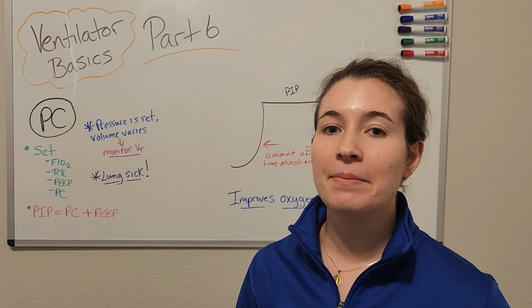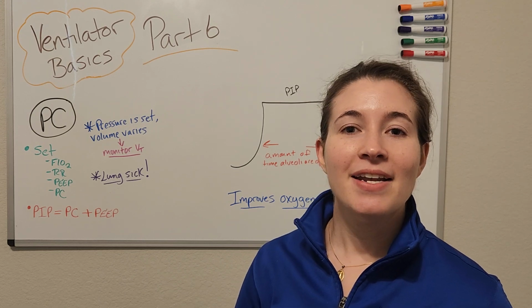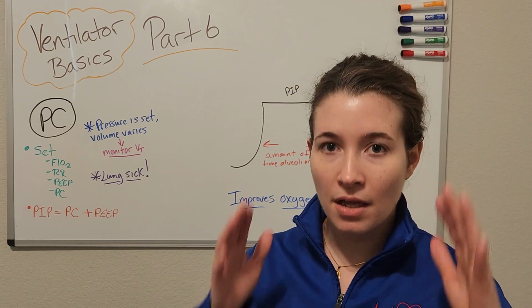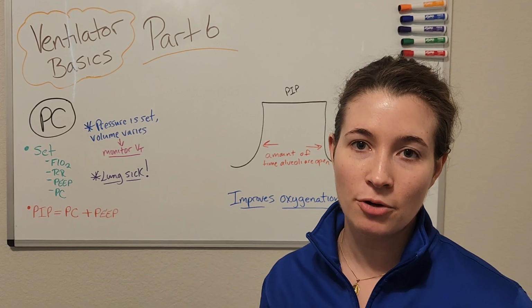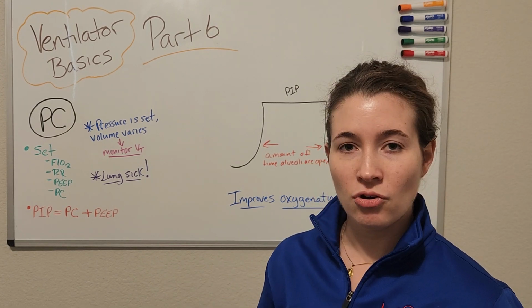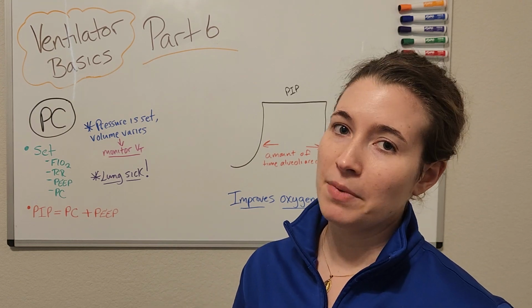In this video, I'm going to be discussing pressure control mode of ventilation. Now, whenever you hear pressure control, I want you to think lung sick. Most likely the primary problem with your patient is their lungs. Now, in pressure control, it's a little bit different from the previous modes of ventilation that we've been discussing.